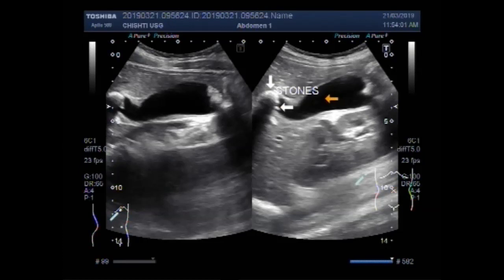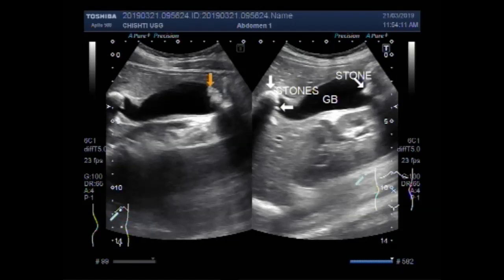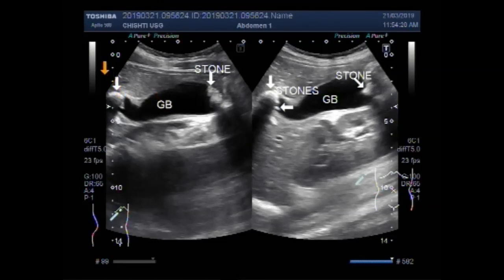This is the gallbladder, and this one is also a stone. This is the gallbladder and this is the stone in the neck of the gallbladder.